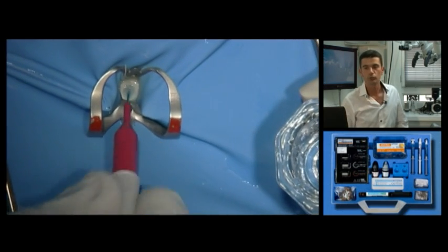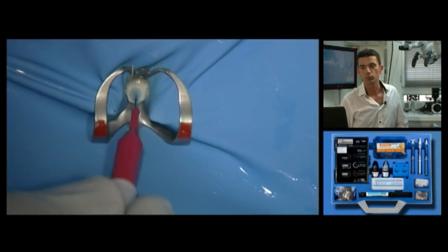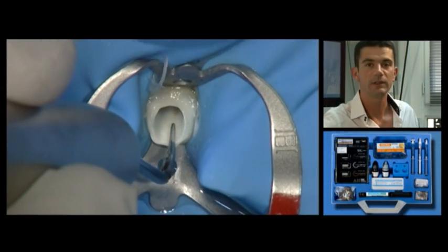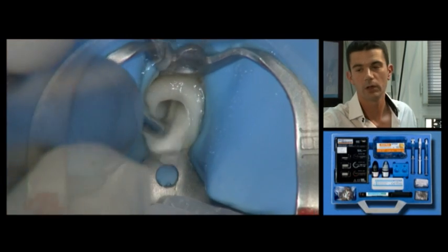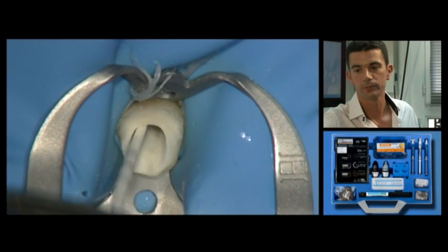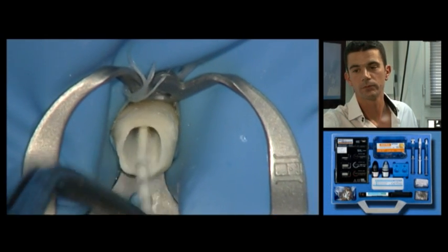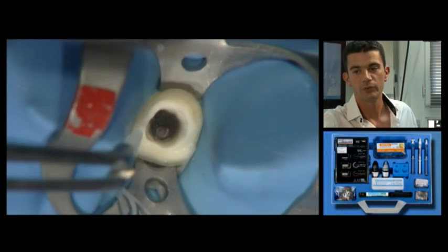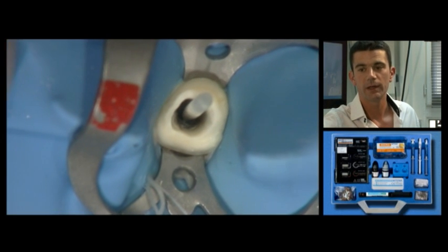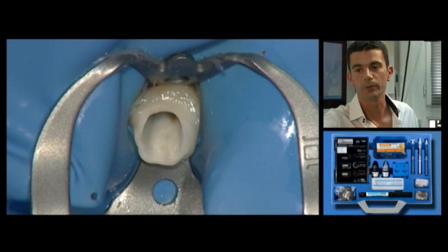The tooth is cleaned with EDTA solution. Here an interdental brush is used to apply the solution thoroughly. The tooth is then carefully rinsed using ultrasound or a water syringe, and then dried with a syringe and paper points. In this occlusal view we see the relationship between the post and the canal. The post must be set up against the gutta-percha and free with respect to the canal.